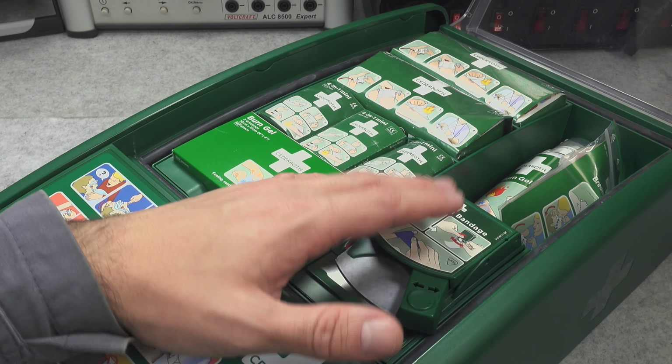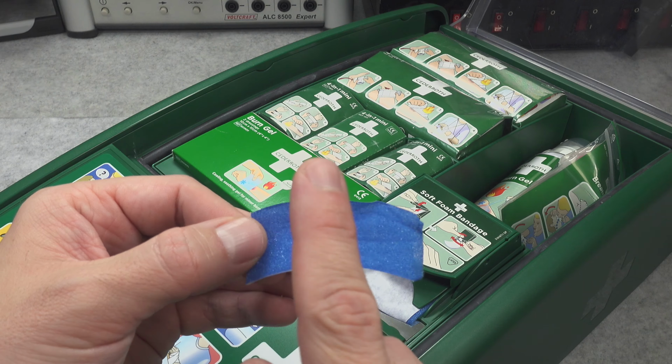Here we've got our bandage, and here we've got a knife that is used for cutting it in an extremely nice fashion. So we first pull a little bit of our foam bandage, just like that. Now I press it and I slide it, just like this. And as you can see, I nicely cut it. After removing the protective layer, this is our bandage, and it is like a foam.